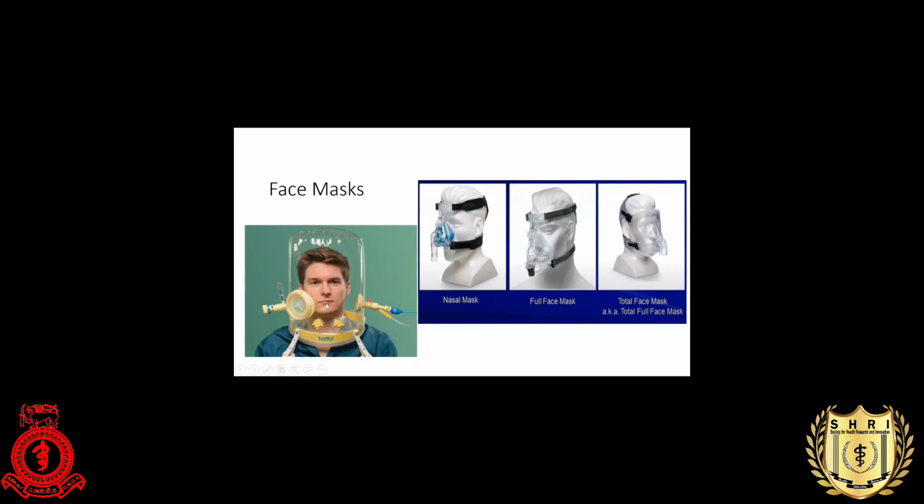The main advantage is that it will prevent environmental contamination in COVID patients, and it will also prevent aspiration if the patient has active emesis. This is the one we usually use in Sri Lanka, and you have to select the ideal size for the patient when you are going to fix this on the patient's face. It should cover the bridge of the nose and the lower part of the mouth. It should not be jutting out from the cheek.